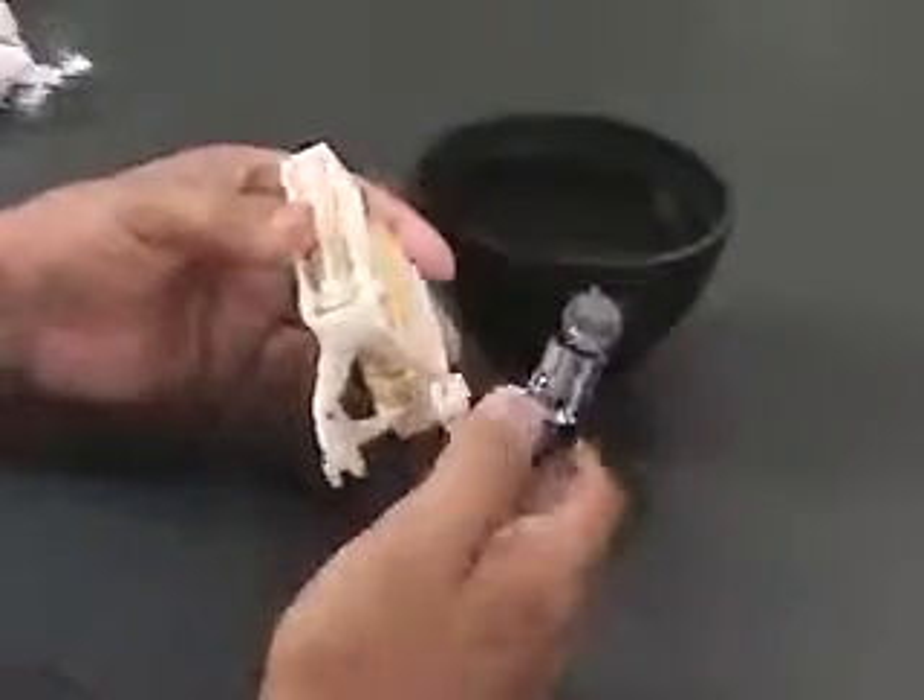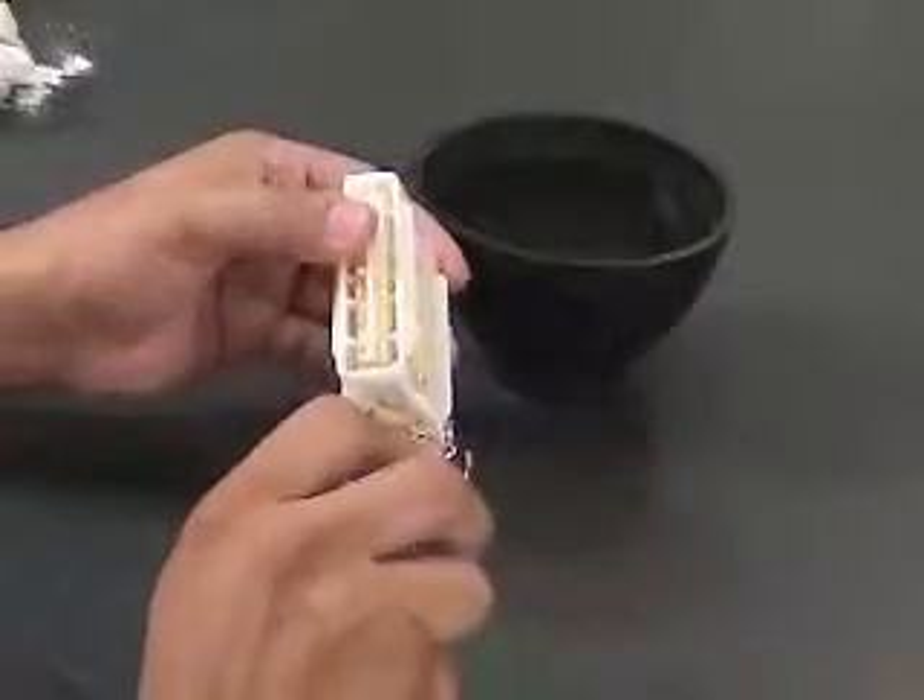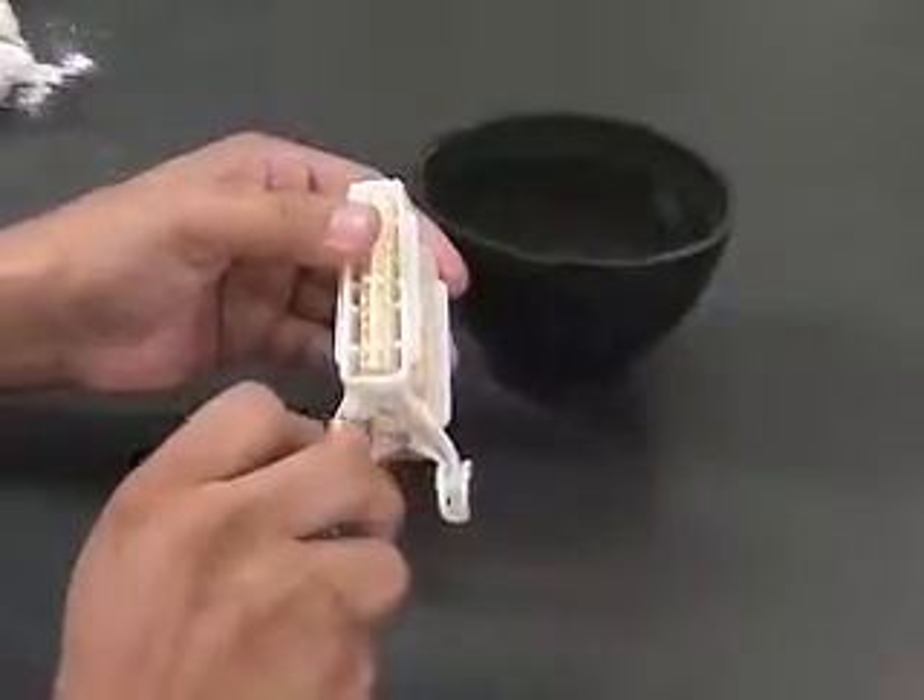Proceed to correct the bite and hold firmly in place. Then dip the arms in cold water for a few seconds to cool them.